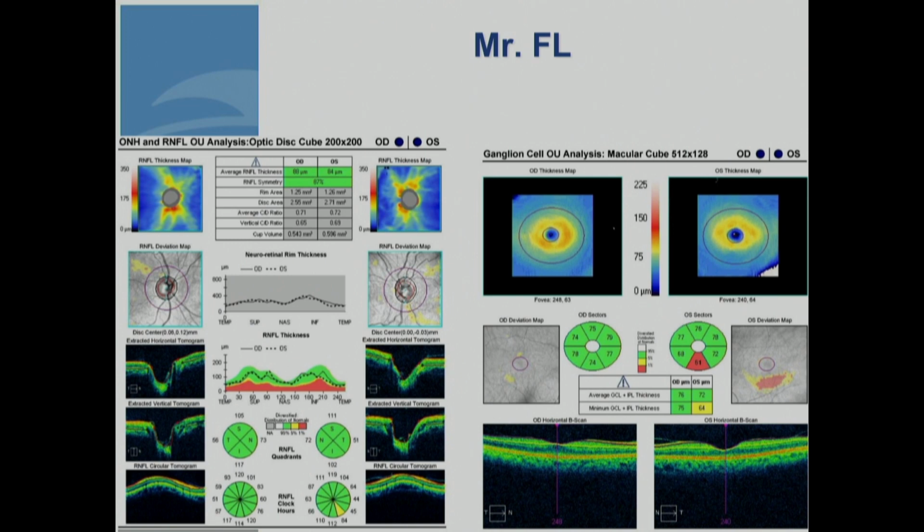in our visual field, and there might be some early changes in the en face image, but that's not really captured well in our clock hours because it straddles a couple of clock hours and is quite thin in the scan circle.